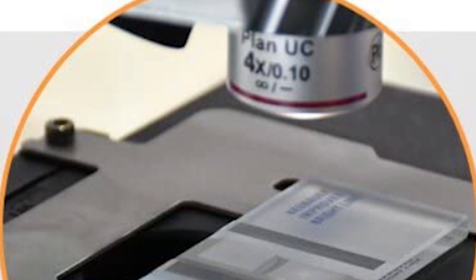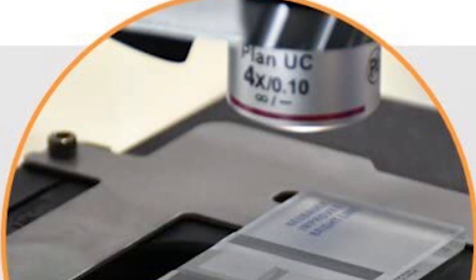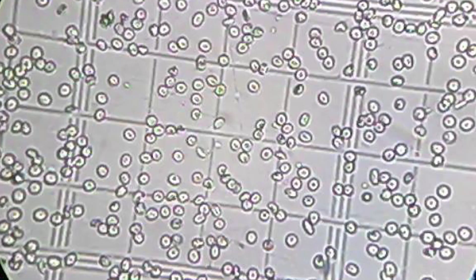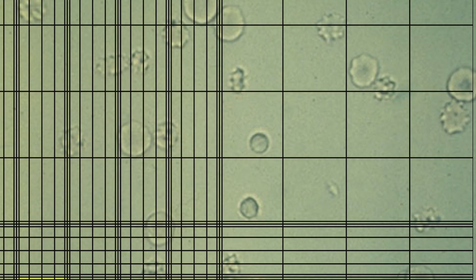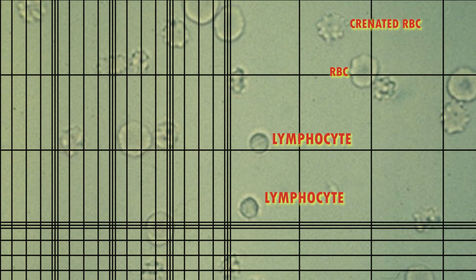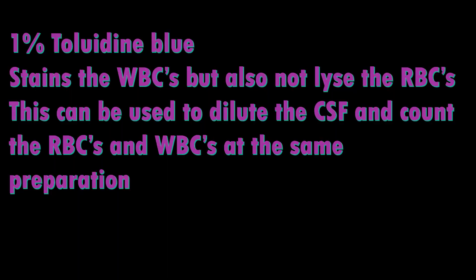After two to five minutes, place the chamber on the microscope stage and focus under 10x, then 40x dry objective. RBCs are identified by their pale yellow color and shining appearance with fine adjustment. Granulocytes are easy to differentiate from RBCs as they are larger, colorless or gray, and have granules. Many techs have difficulty differentiating lymphocytes from RBCs because both are similar in size — color and shining appearance are key. A touch of toluidine blue stain can stain WBCs to aid differentiation.